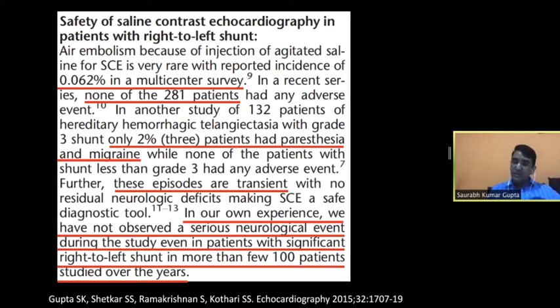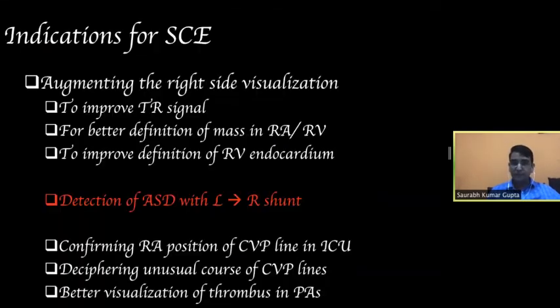In our own experience at AIIMS New Delhi, we have not observed a serious neurological event during this study, even in patients with significant right to left shunt, in more than a few hundred patients studied over the years. And this I am saying on behalf of almost everybody in the department.